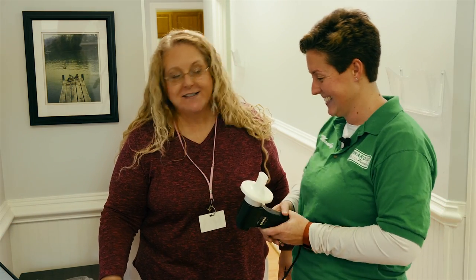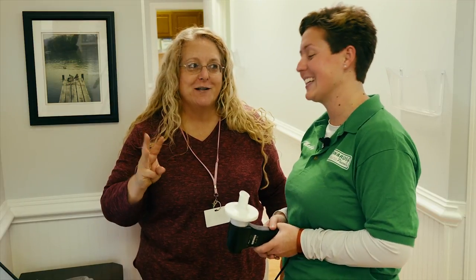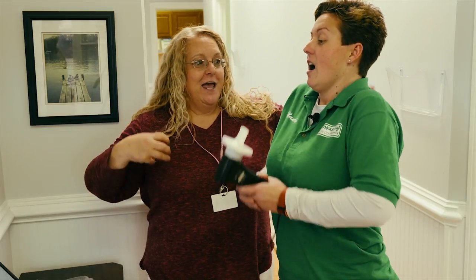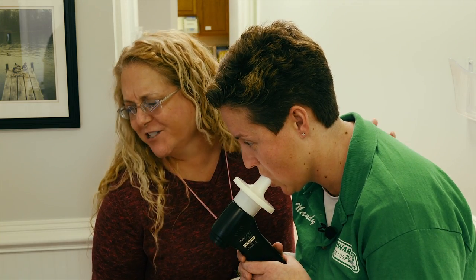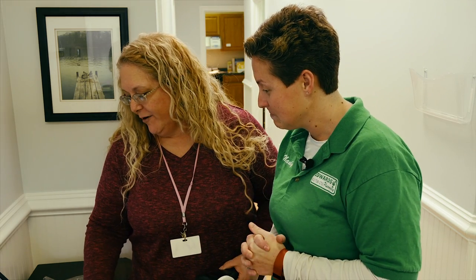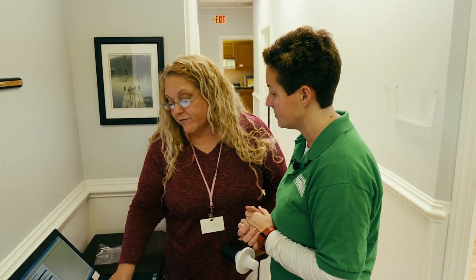Now, the computer's going to say that was a little easy for you, and it's going to make it a little difficult for fun, because we need three good tries. I'm always up for a challenge. All right. And you really still got to gut it out. Big breath in. And blow. Punch it. Push. Great. One candle left. That's okay. That's good. And then we print it. It does an evaluation, and then Dr. Gales will go over the results with you.